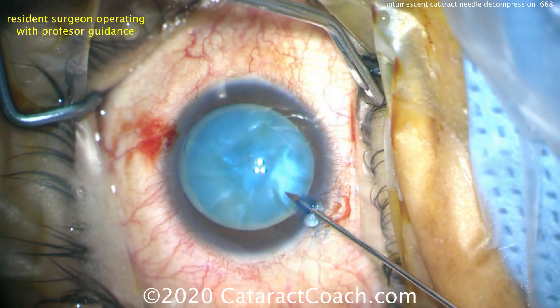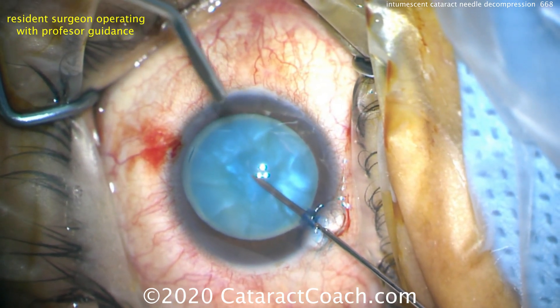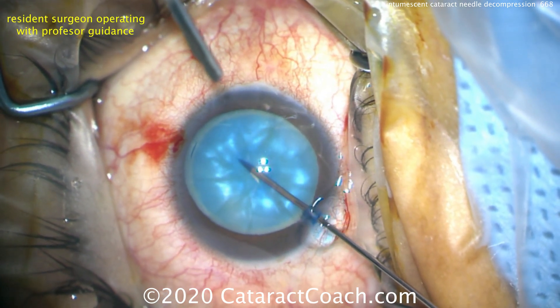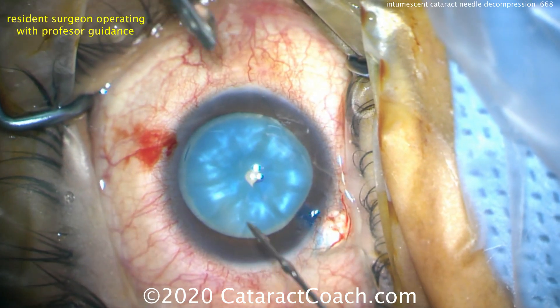Now we're going to show you the same technique of needle decompression done by a resident surgeon — a surgeon in training with about a hundred cataracts of experience. The needle goes in beveled down, puncturing the lens capsule, and then actively aspirating, pulling fluid from within the capsule bag.